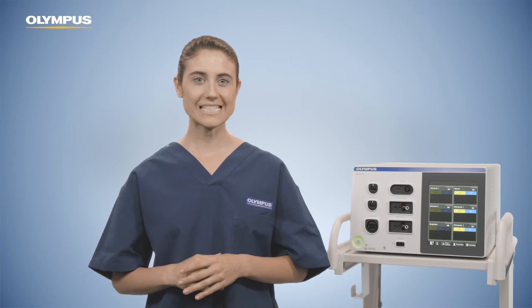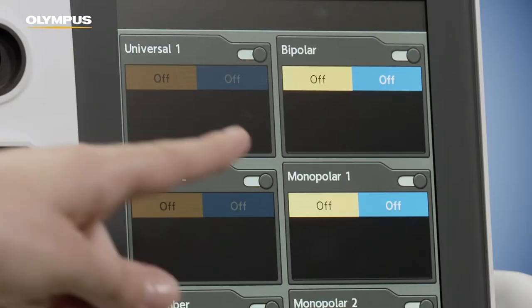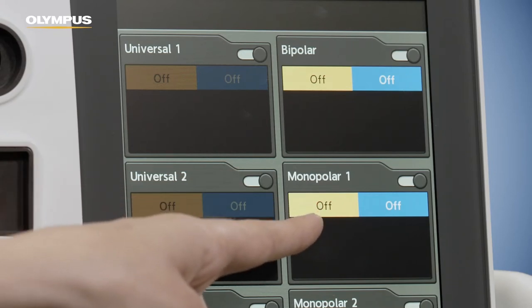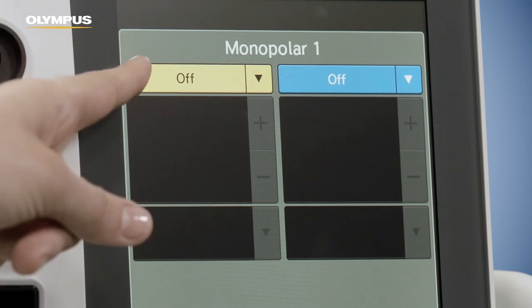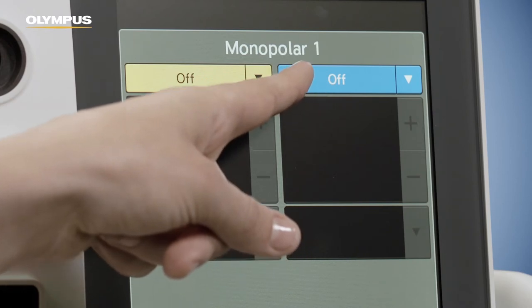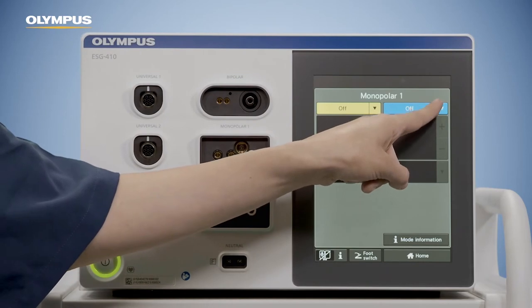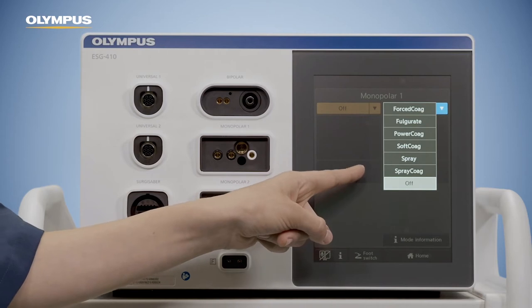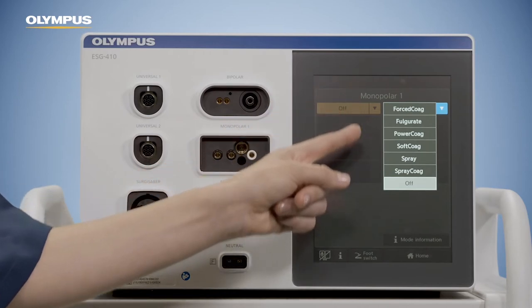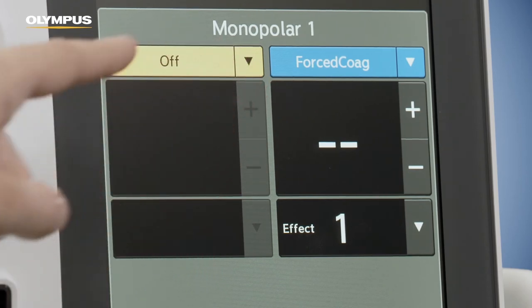The second layer is the set screen, where you can change the settings of one selected connection area. Tap the pane of the required output socket to get to the set screen. The yellow bar shows the selected cutting mode and the blue bar shows the selected coagulation mode. If you click on the mode name button, a drop-down list appears showing all possible modes for this socket. The ESG 410 provides a number of different modes that produce different tissue effects. Tap the mode name you prefer to select the waveform you require.